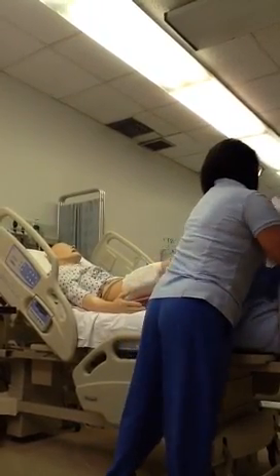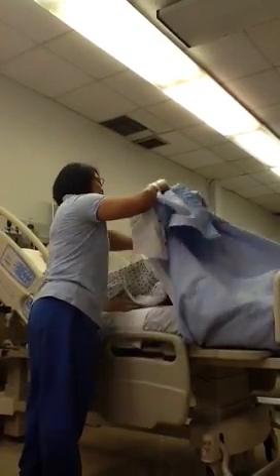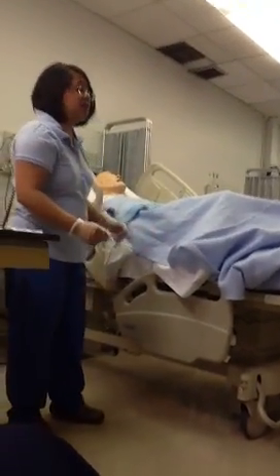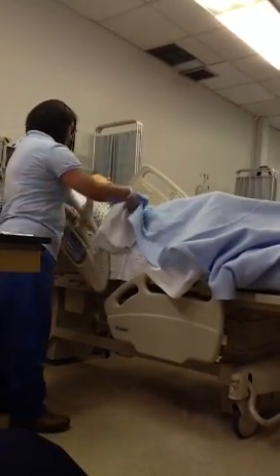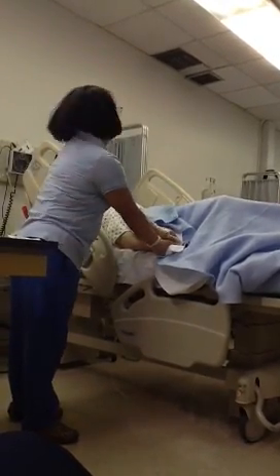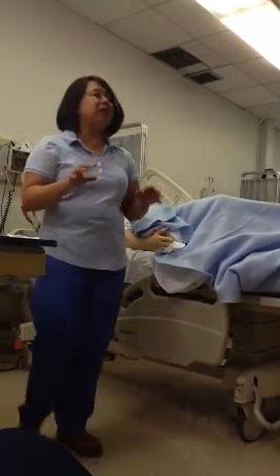Okay? Now, I'm here to tell you, there is no stinking way that he is going to last 5 to 10 minutes. Okay? I've never seen a patient that lasts 5 to 10 minutes of holding a cleansing enema. Okay? But you definitely want to give him some privacy. So, before I leave, I'm going to give him his call light. I'm going to actually put it in his hand. I'll say, Mr. Mannequin, I want you to try and hold this for 5 to 10 minutes. Okay? Take my gloves off. I'm going to wash my hands. I'm going to leave, but this is not where you go.